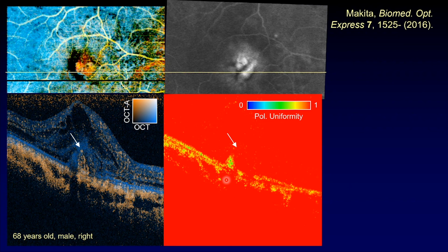The melanin accumulation, this one. And in addition, here, there is a weaker melanin signature at the retinal pigment epithelium. In the OCT scattering, there still is the retinal pigment epithelium, or at least it looks like the retinal pigment epithelium exists here. But by checking the melanin signature, the tissue has already been damaged.